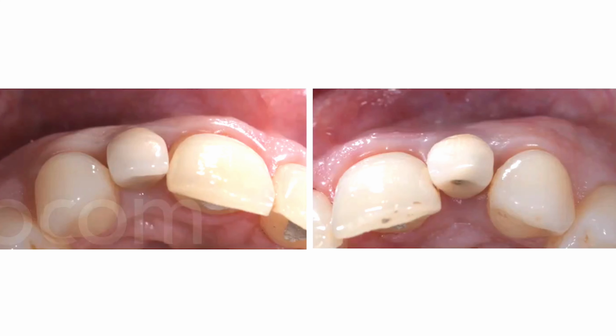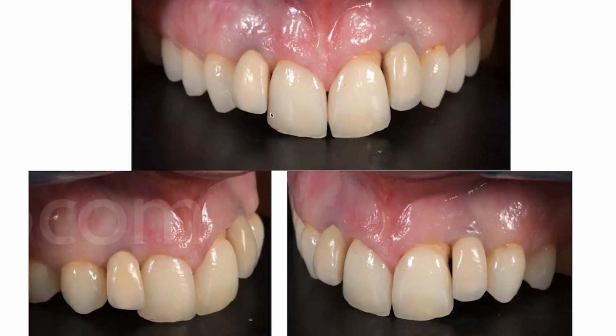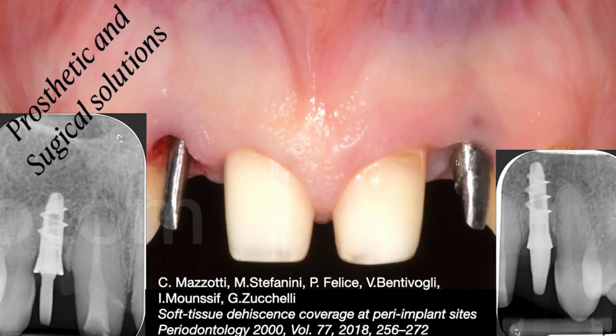And the tooth, since we have a lot of extrusion of the two central, you see how much these teeth extrude, and this is very bad in the patient's smile. We have to sacrifice some of the central that needs to be covered with some veneering. So we gain space. How can we gain space? Reducing the abutment as much as possible and making a sort of crestal preparation of the abutment, like BOPT, if you want to call it.